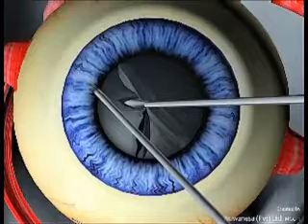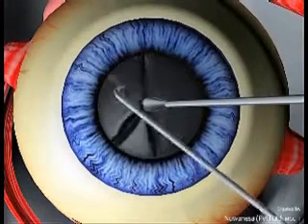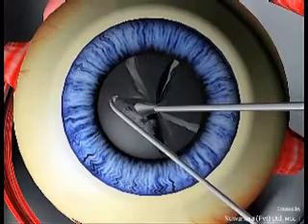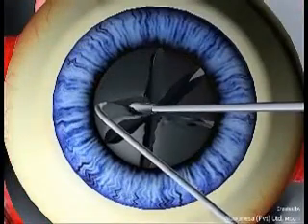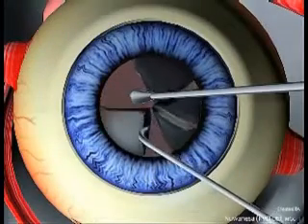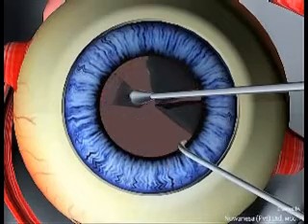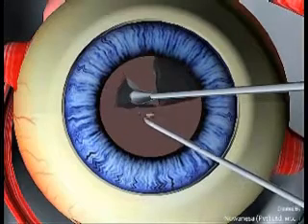Depending on your preferred technique, each half can be divided into three or four fragments. Once the fragments are made, it is not difficult to clear the capsular bag from the cataract fragments.